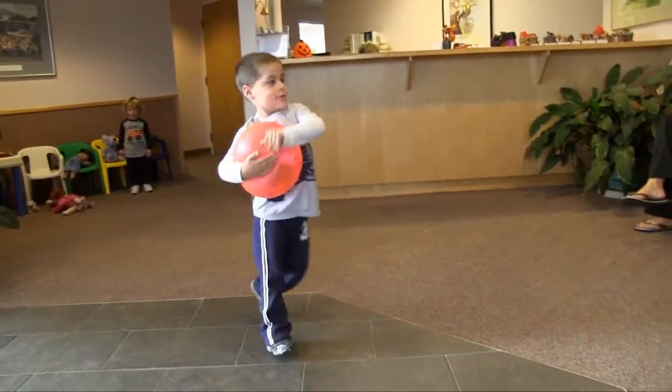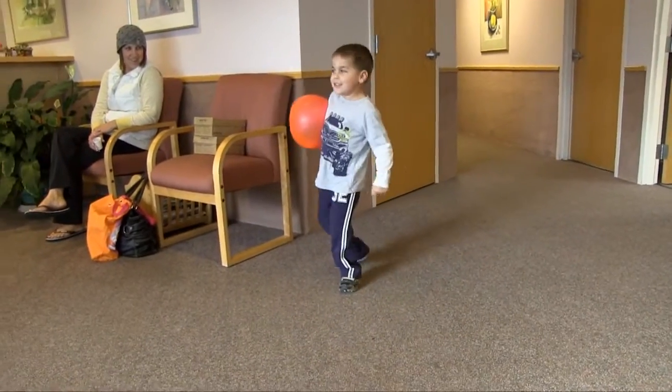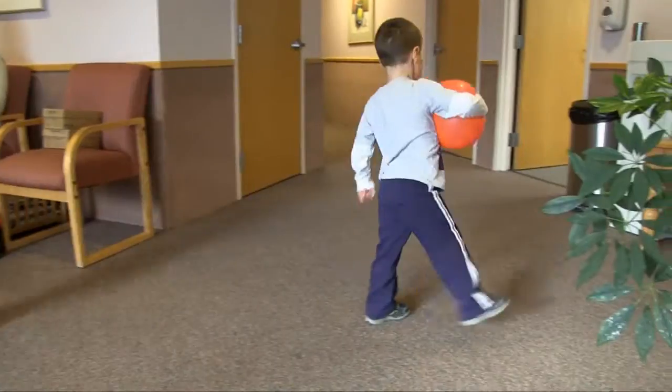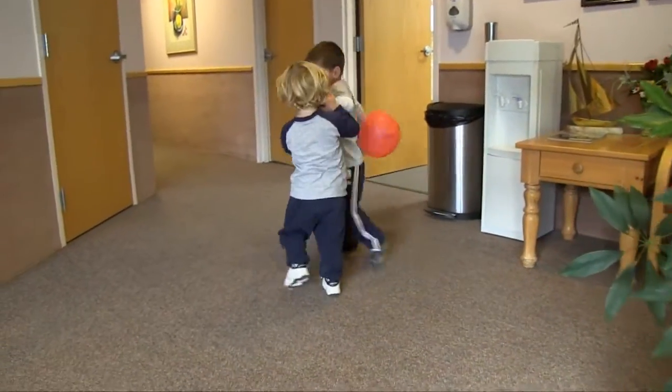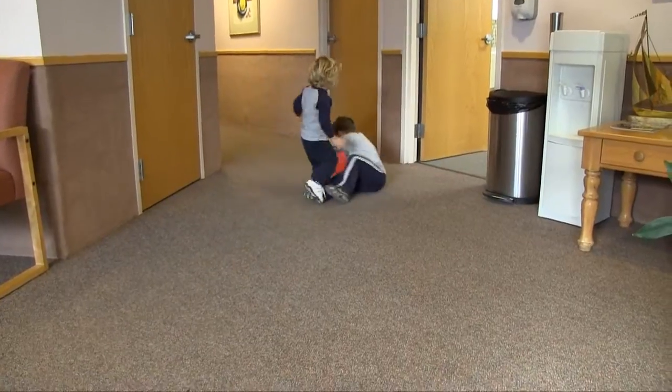This is one of my patients who is four years old. He has a diagnosis of spina bifida, playing there with his brother. I've been working with him since he was 14 months old. His level of spina bifida is L4, L5.